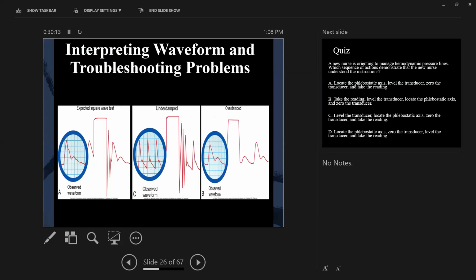All right. So if we think there's something wrong with our waveform, we will troubleshoot. If you remember, I said that little blue pigtail, and when you go back to watch this video again, you'll see it even closer. What we do is something called a square wave test. I'm looking at the monitor, and I want you to look here. This is the waveform. Do you see it right there? Beautiful waveform. And I do this square waveform test. As I'm looking at the monitor, I pull that pigtail and I'm flushing the line.